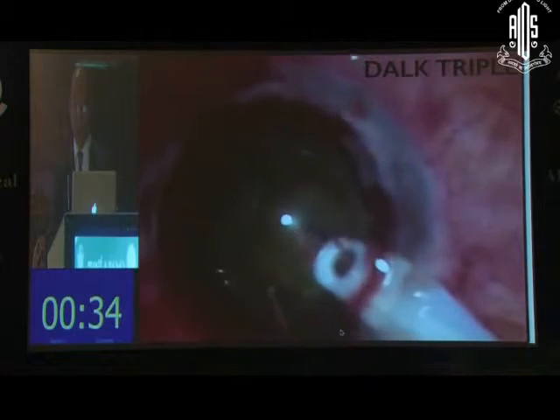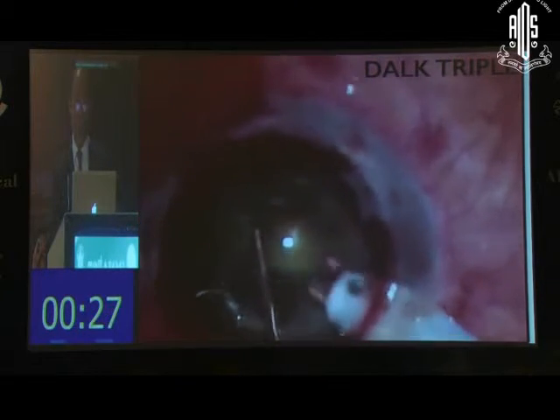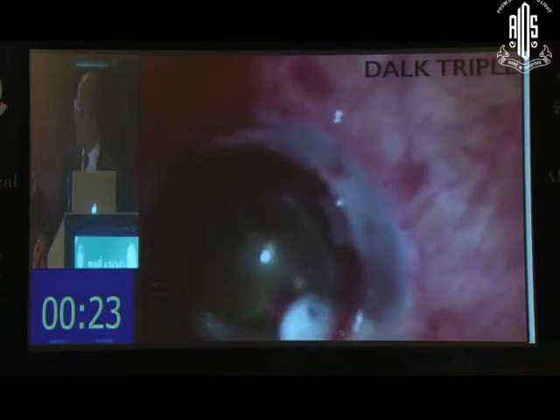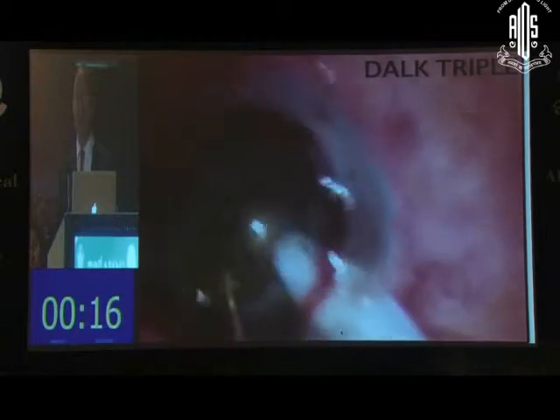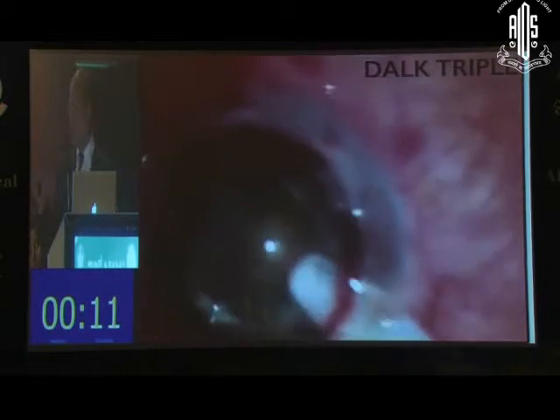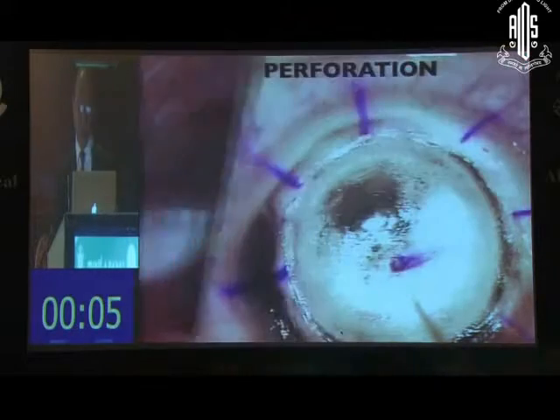Sometimes if you have a cataract along with corneal opacity or ectasia, you can combine the two. You can do dissection of the stroma and do the phaco and then go back and put your donor button. In this particular case, we have gone down to the Duas layer and we're doing the phaco with that, but perhaps this is not such a good idea because the layer is very thin, it may rupture with the pressure in the anterior chamber. So now what I would do is do a lamellar keratectomy, enough to see, then do the phaco, and then complete my dissection and then do the suturing.